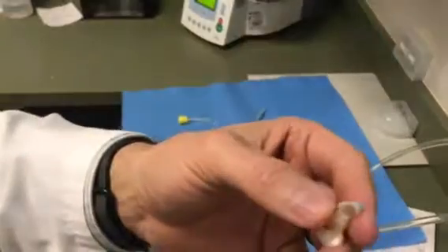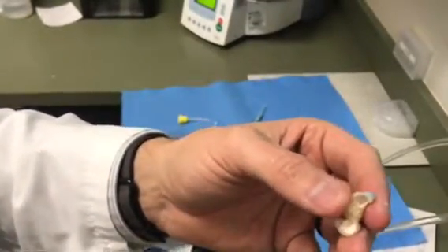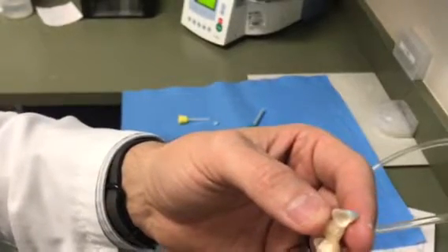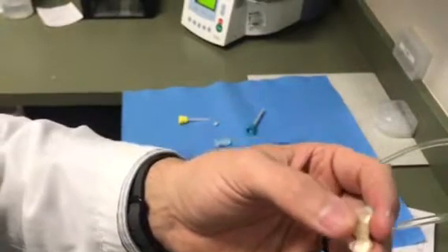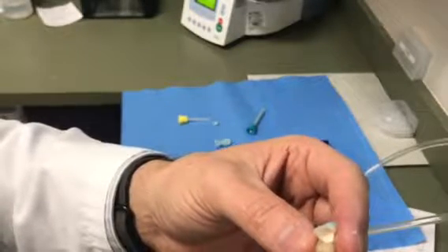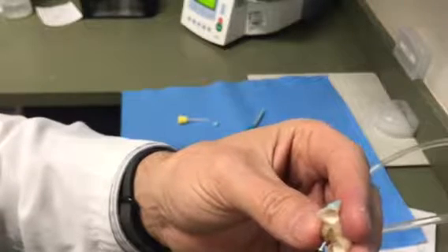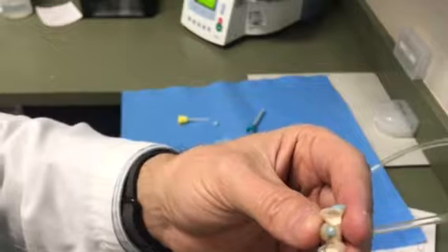The other thing that I'm really picky about is the intaglio on the Pontic site. Me having a bridge and getting food stuck in there and knowing the difference between bad and good on my Pontic site makes me a pretty big stickler on that. So same thing, I rough up the porcelain, take off the glaze, add just a little bit of bond so this sticks, and then, wanting to close up my Pontic site, I'd add to this.